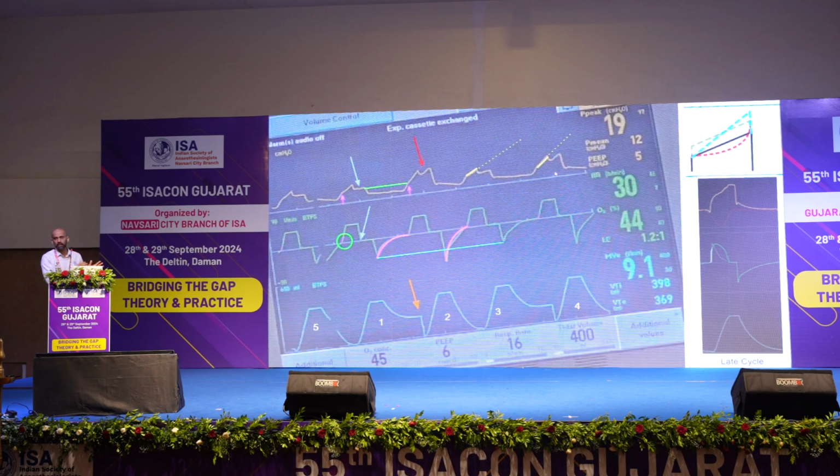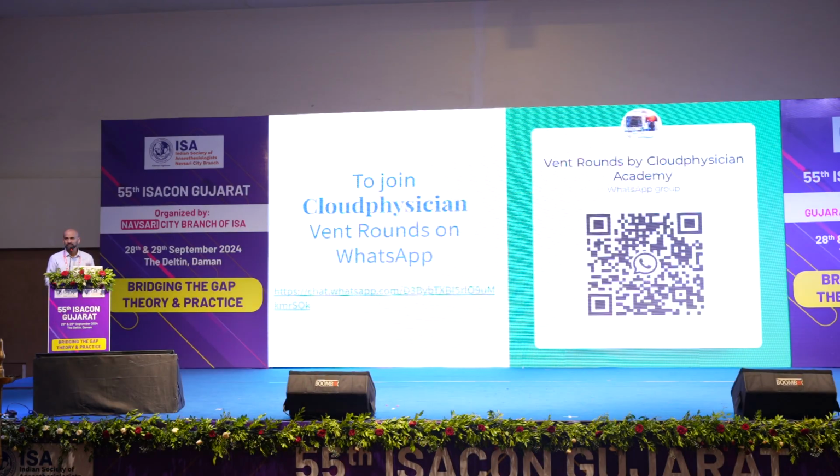And each of these abnormalities you can train yourself to see on successive waveforms. Some of them are easy, some of them will take practice. So by practice I mean you can log on to this. It's a continuous session, it's free, you can join. And what we do is you can share cases on this WhatsApp group, and we'll discuss those cases going through the same thing: tag, load, PV, relationships, and then arrive at a diagnosis. So hopefully this was a trigger to start a practice session for how to analyze ventilator waveforms.